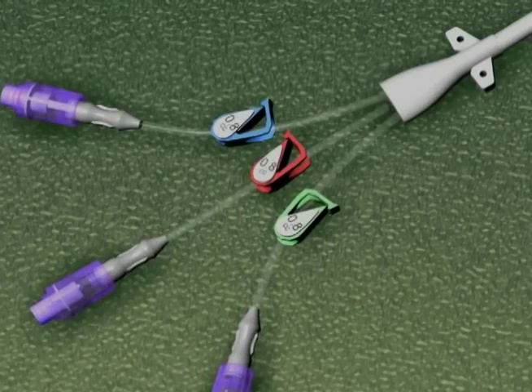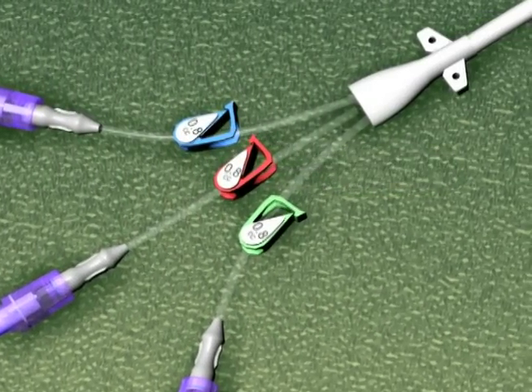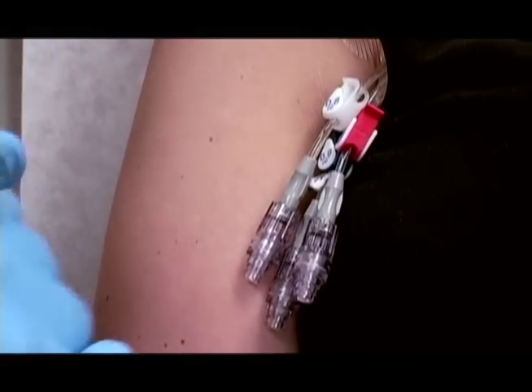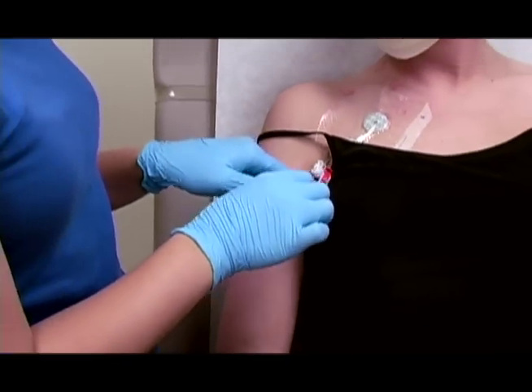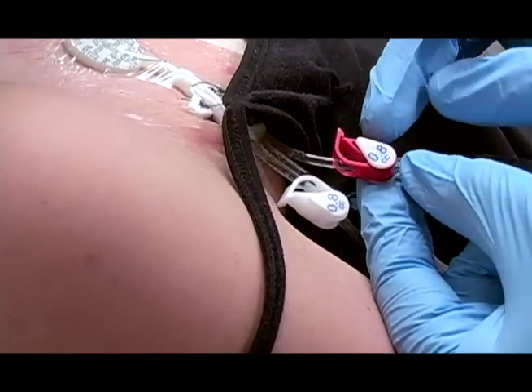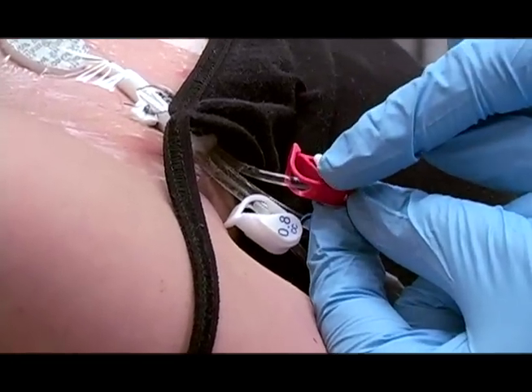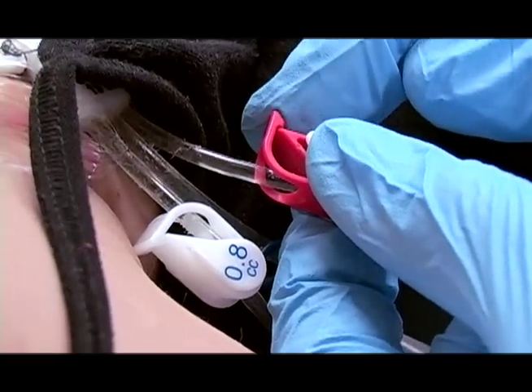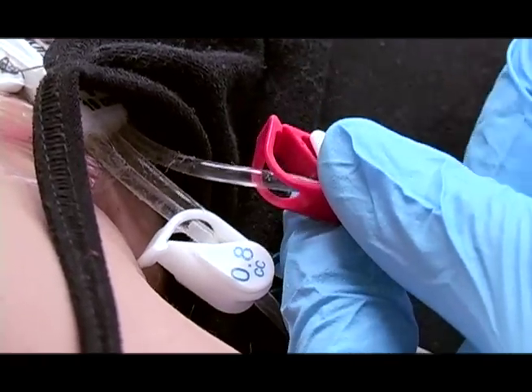If your line has clamps, make sure the clamp on the particular line is open before you begin cleaning the cap. You want to make sure, if you have clamps, that the clamp is undone. When the clamp is open, the triangular part of the clamp will rest outside the top hook. So I'm going to go ahead and unclamp. Take your finger at the finger hold and you almost take this lip to make sure that it's undone.